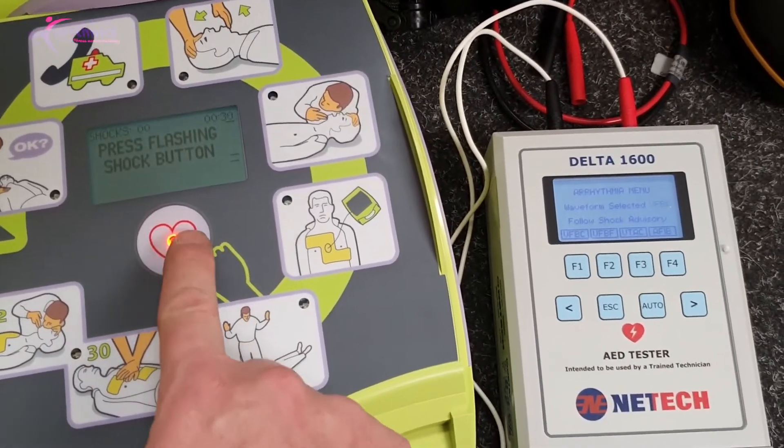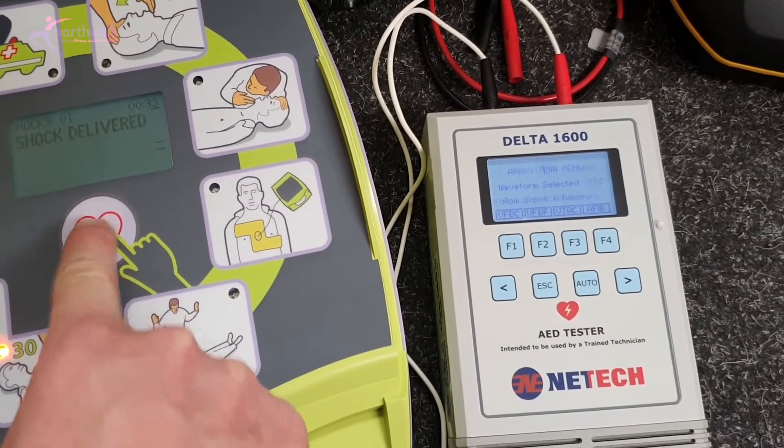Don't touch patient, analyzing — shock advised. Don't touch patient, press flashing shock button. Okay, so that's the same as before — it's recommending a shock. I need to press this button.